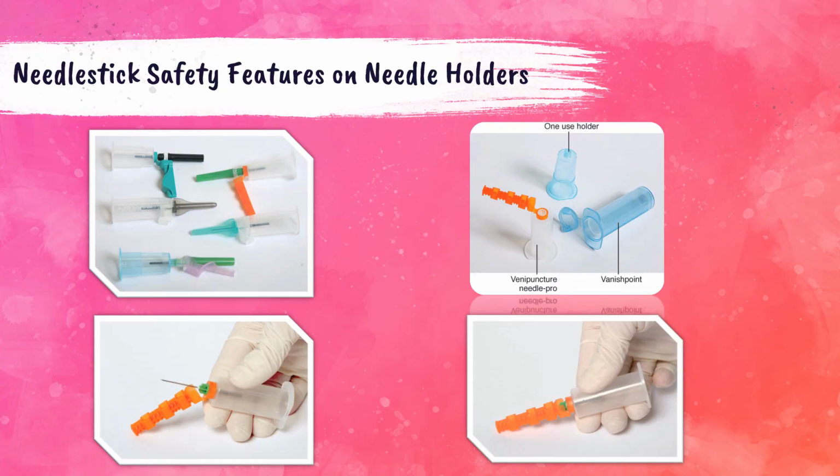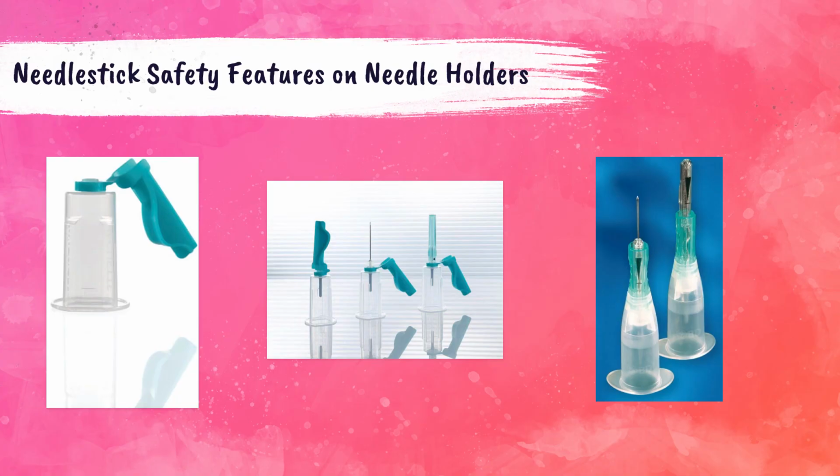This slide shows pictures of some examples of evacuated tube systems with safety devices. Notice in these bottom two photos, this is the correct way to activate a safety device. The safety device must also always be activated as soon as you remove the needle from the arm against a hard surface, then disposed of immediately into a sharps container. This is an example of a holder with a safety feature that retracts the needle into the holder. All needles and holders must go into a sharps container with the device activated. It does not make it safe for normal trash disposal.